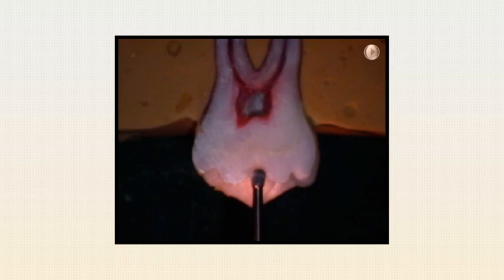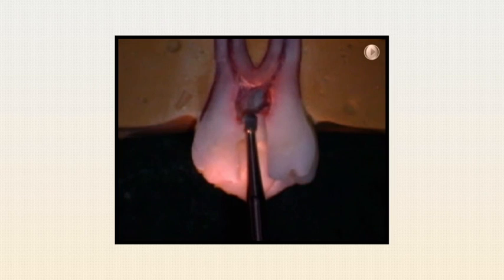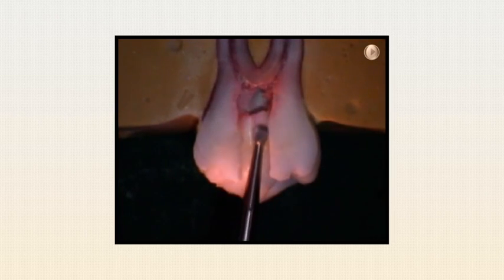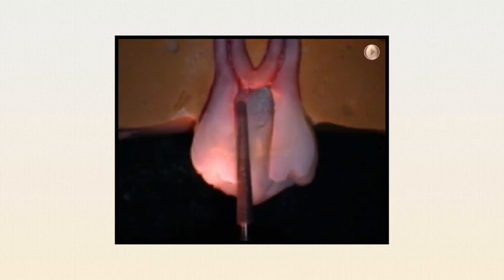And again, this video is to demonstrate the penetration phase of the actual endodontic access preparation. With the round burr, you notice a penetration phase to the highest point of the actual roof of the chamber. Notice the drop through, the sensation of dropping through, and then with a brush technique toward the coronal, we enter into the enlargement phase, ridding of any overhang of the pulpal chamber ceiling so that all debris, organically and inorganically, can be removed.